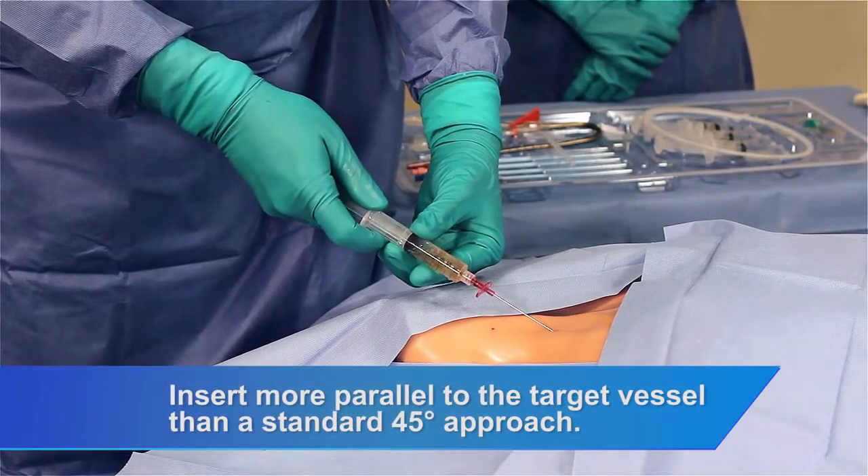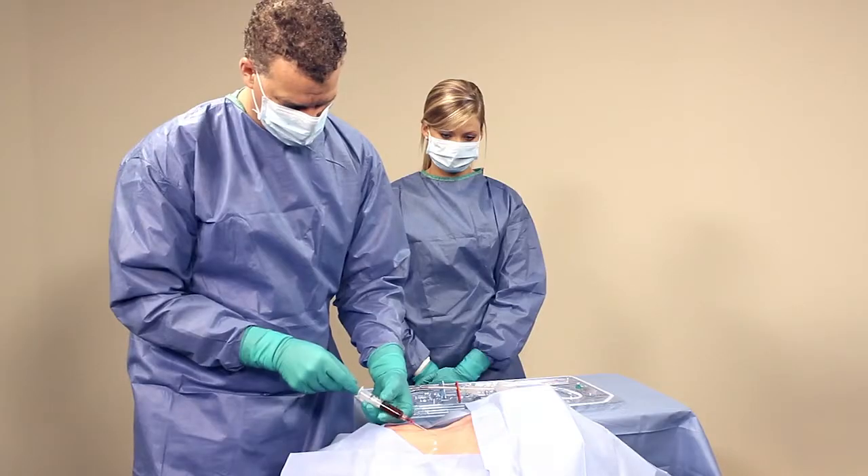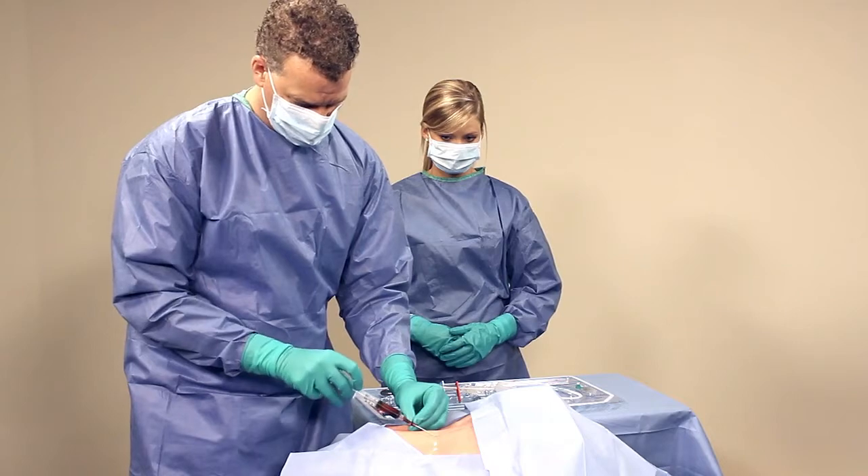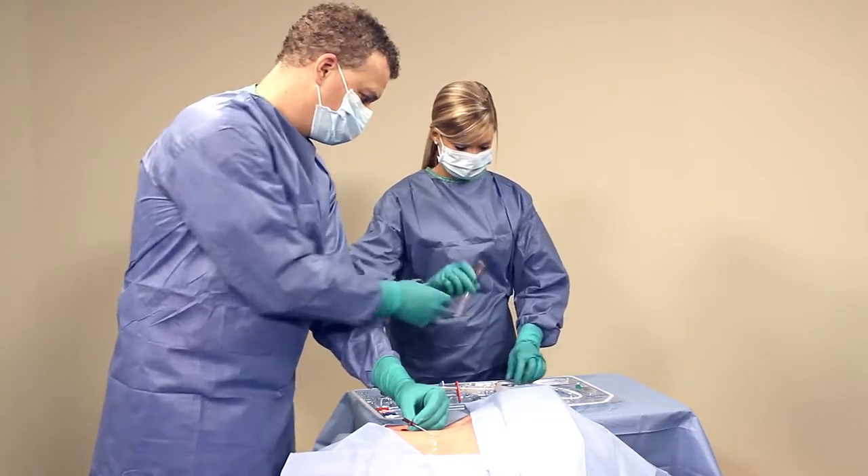Aspirate to ensure proper placement. Once blood has been aspirated, remove the syringe and place your thumb over the end to prevent blood loss or air embolism.